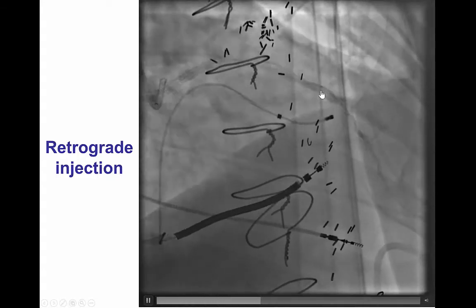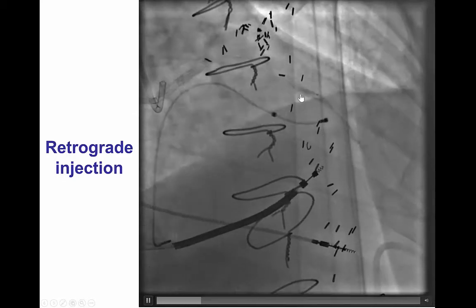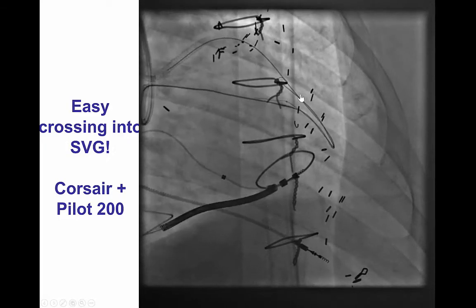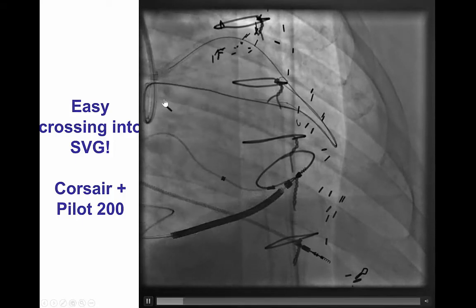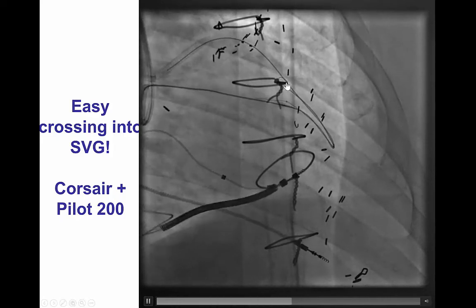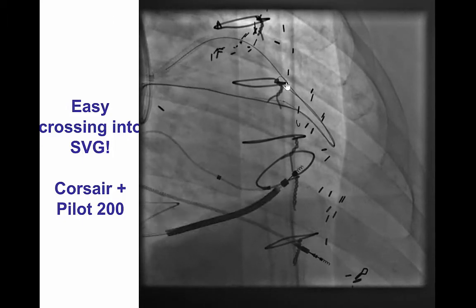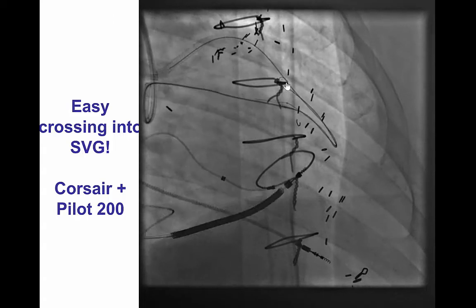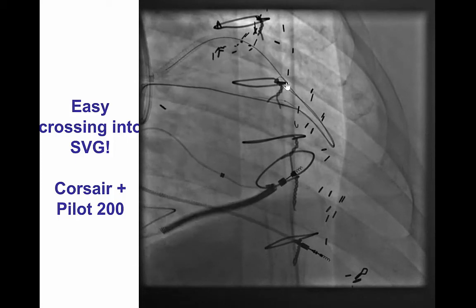We advanced the Finecross to the distal cap and performed a retrograde injection, but it didn't look very crisp and we had a lot of difficulty advancing retrograde wires. We then decided to try a quick antegrade wire attempt, and to our surprise, a Pilot 200 essentially crossed the entire occlusion antegrade into the vein graft within minutes. This illustrates that you should not attempt retrograde without first giving at least a brief antegrade try, because occasionally, as in this case, you can get easy crossing in the antegrade direction.